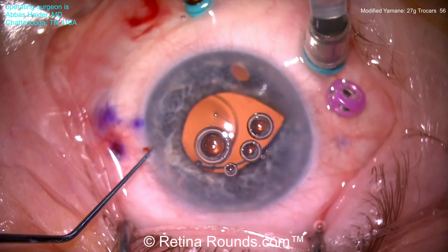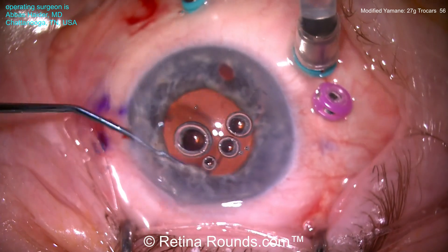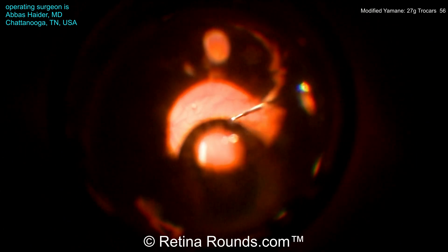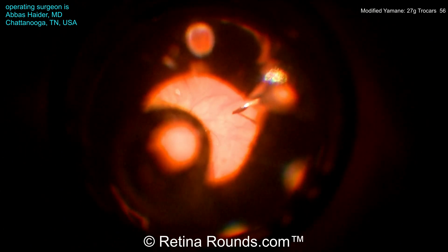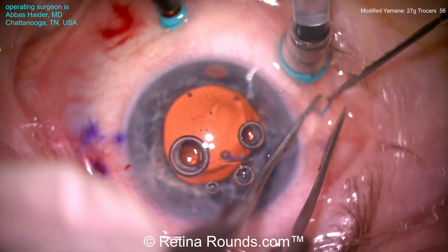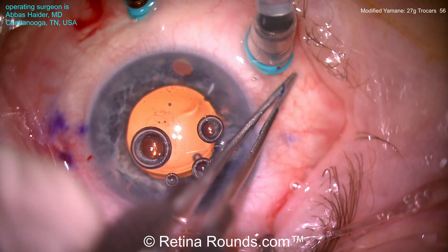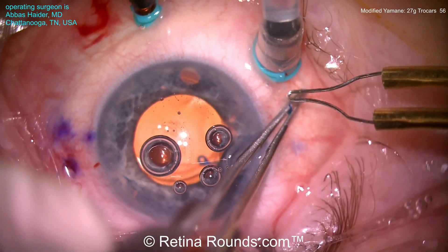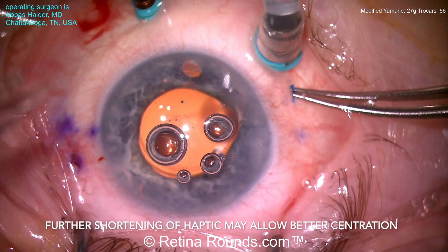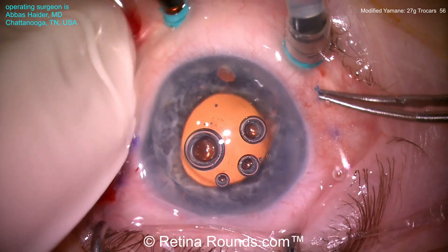Now the other haptic can be rotated so that it's free of its adhesion to the iris, and that side of the haptic will be dangling down into the vitreous cavity. Using a Max Grip forcep, that haptic tip is being grasped. Ideally, you'll want to grasp the haptic so that it is parallel to the path of the Max Grip forcep. Now that haptic is being externalized — keeping it parallel to the forcep path decreases the risk for kinking. A small flange is being created again with the low-temp cautery, and that haptic is being reposited back through the sclerotomy site through the scleral tunnel.